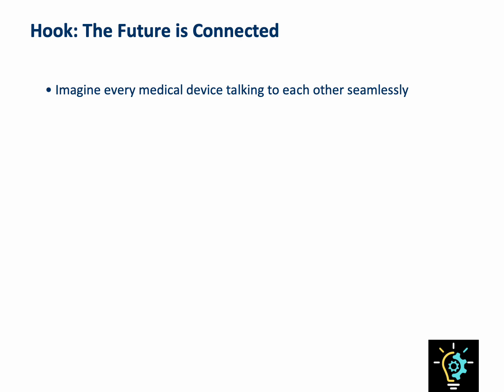Let's build an image of what the future looks like. Imagine walking into a hospital where every device is part of one conversation. The MRI scanner does not just create images, it automatically transfers them to a surgeon's screen. Infusion pumps are monitored by a central system which can alert staff if a parameter is out of range. A wearable sensor on a patient at home sends updates directly into the hospital's electronic records.